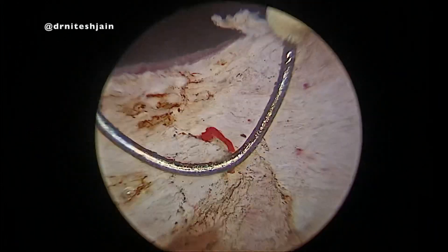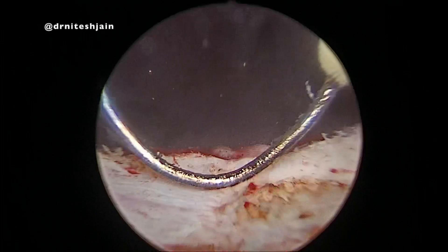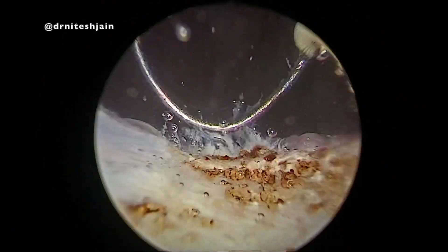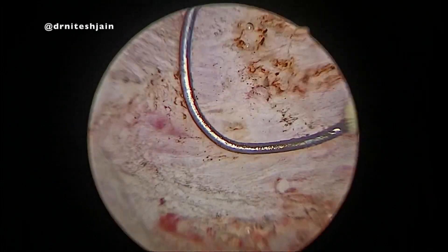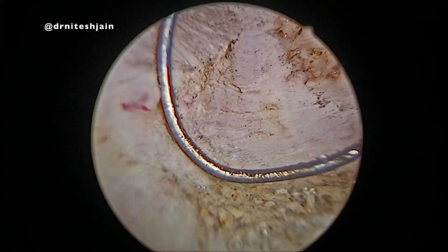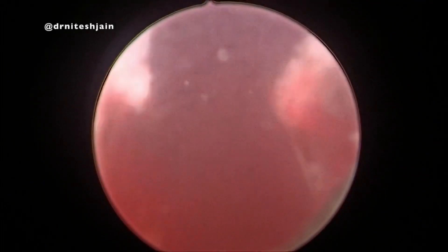The tissues are removed and a few tissue samples are also sent for culture. It is better to send for both bacteriological and fungal culture, and in case of doubt, for TB as well. The irrigant is cut off when the final fossa is seen for hemostasis.